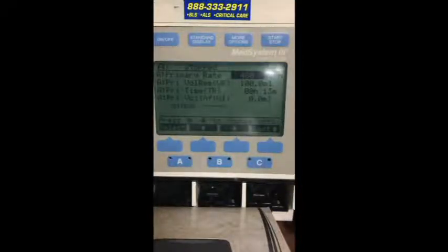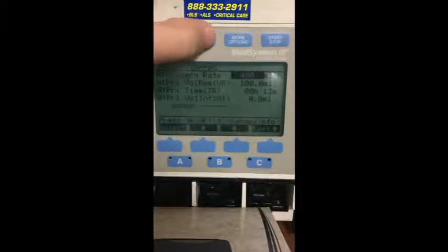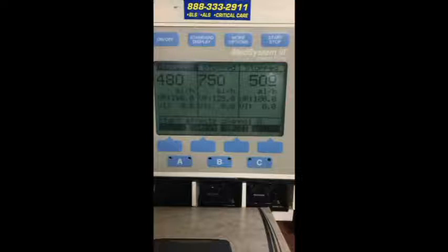Once it runs out and you're done with your infusion, it will say KVO and beep at you. And KVO for this is set up to 3 mLs per hour. So essentially stopped. To turn it off, you just hold the on off button.